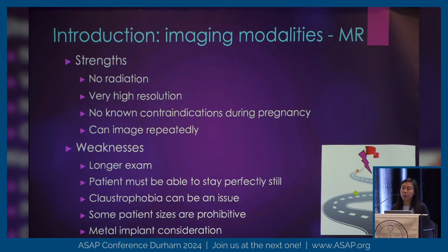So a lot of metal implants, like pacemakers and other cardiac devices and lots of other things that are implanted, a lot of those are actually okay now. There's a lot of studies going on to basically show this, no harm done. People can't really prove a whole lot, but if you do it at the 1.5 Tesla, which is our lower clinical scanning Tesla magnet strength right now, the higher one is 3 Tesla, they're actually pretty safe. So most academic institutions, not the smaller community hospitals, will provide imaging of metal implants with consents and with backup staff available, backup faculty and physicians.